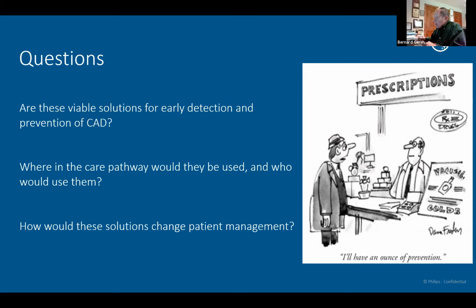When you take the same algorithm and take it to a slightly different group of patients, you can't predict its efficacy at all. You have to revalidate everything all the time. So what may be useful in a carotid plaque may not apply to plaque in the coronary.